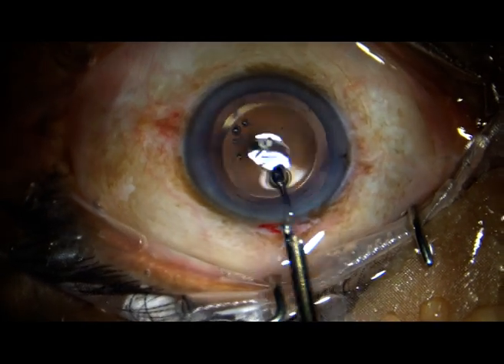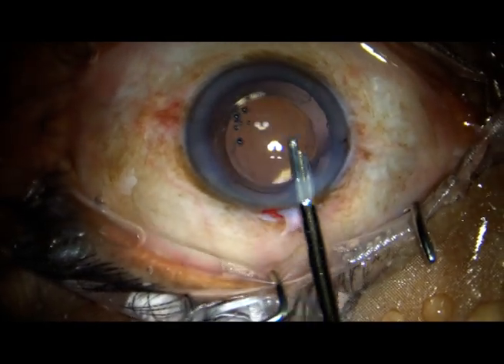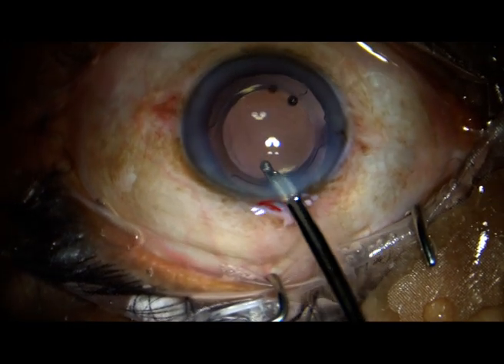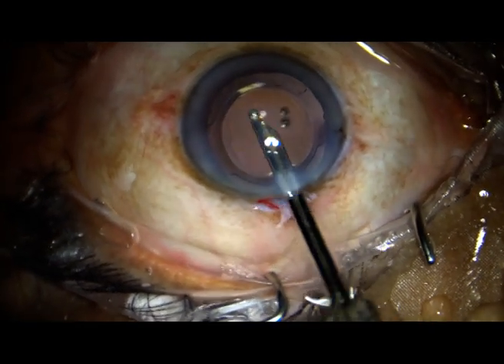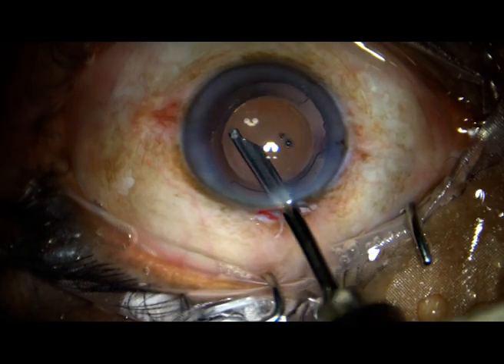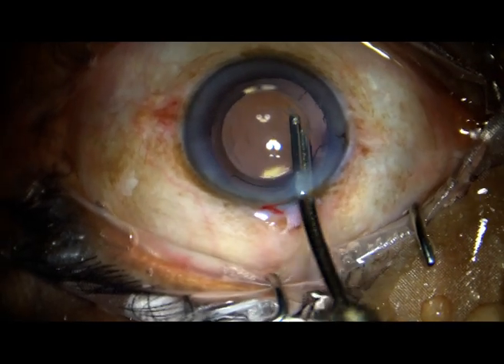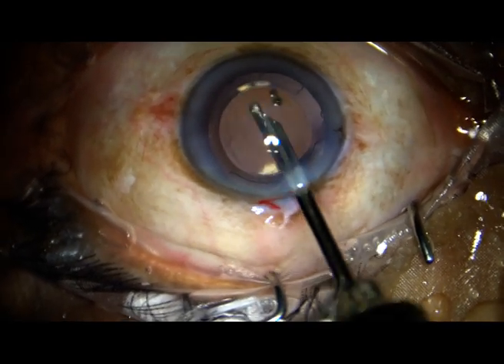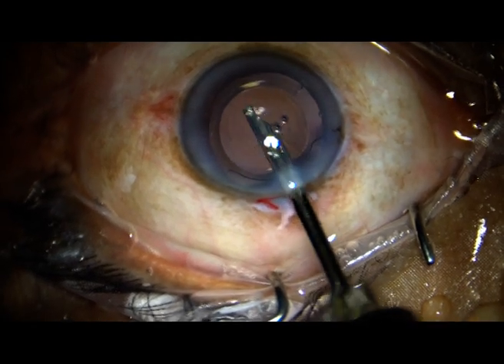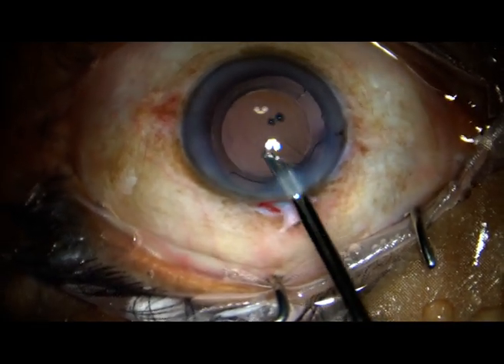Hydrophilic single-piece lenses are well-tolerated in the sulcus in our experience, though reports may vary. Hydrophobic single-piece lenses, we usually don't implant in the sulcus.